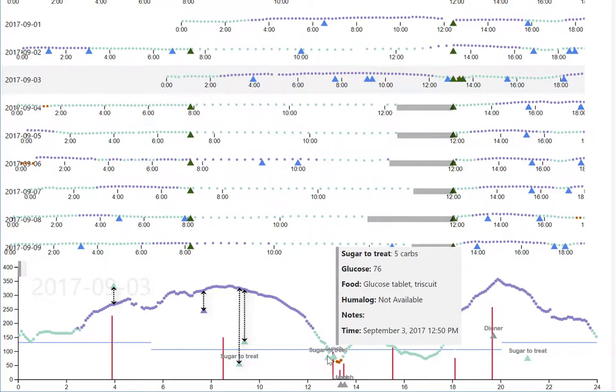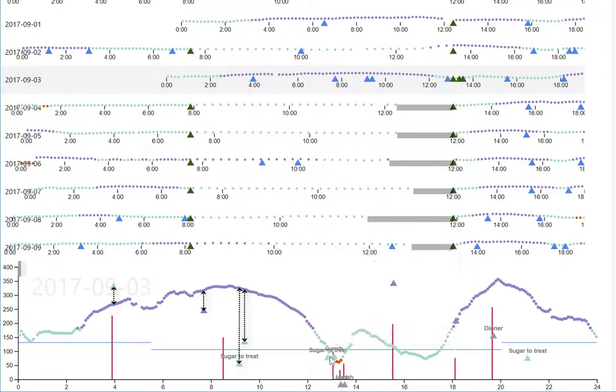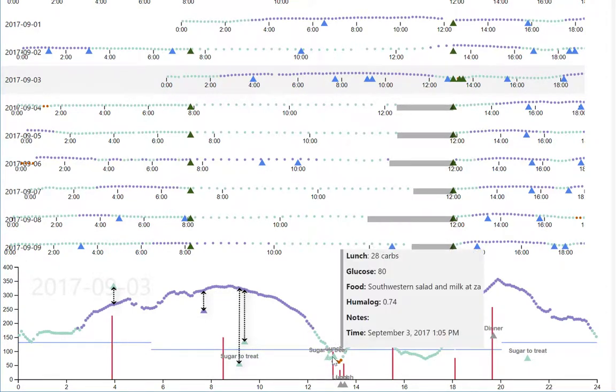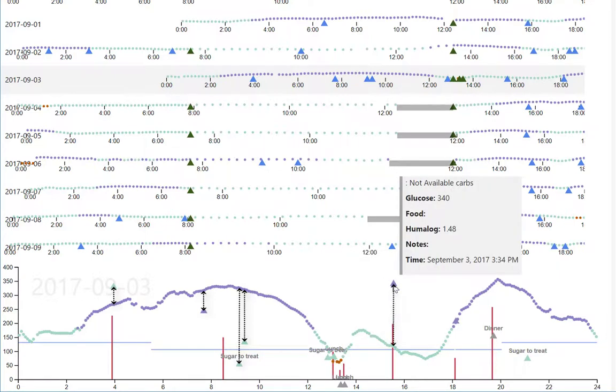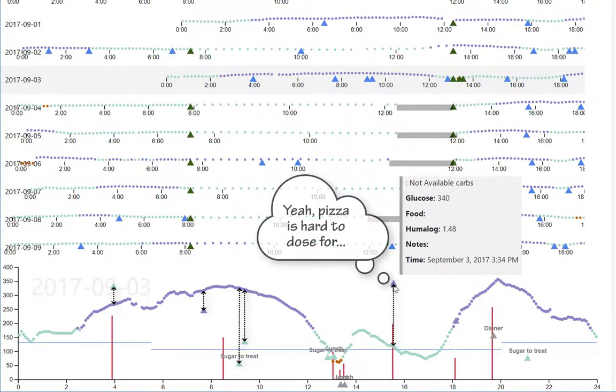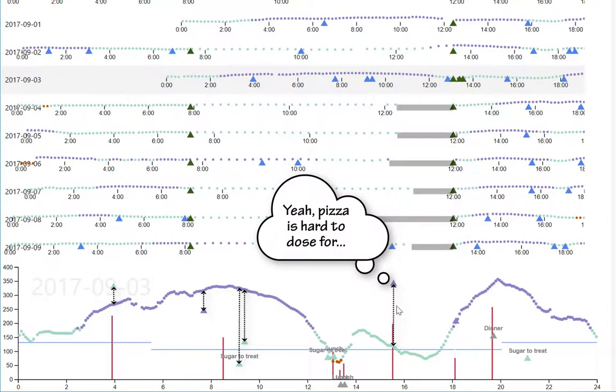This looks like a rough lunch over here. I see the patient ate several things including pizza. Pizza is hard to dose for because of the mix of fast-acting carbohydrates and fat. That explains some of the discrepancy here and the high blood glucose values.